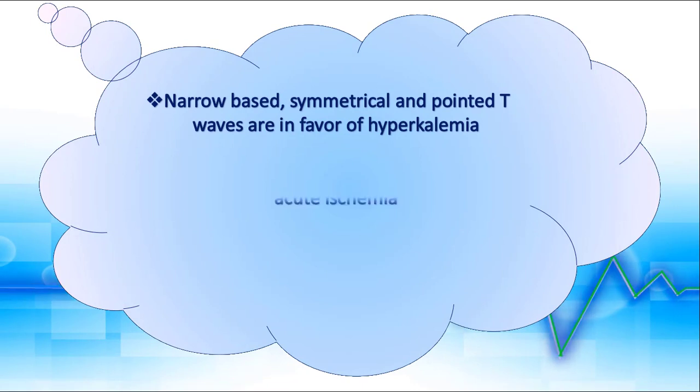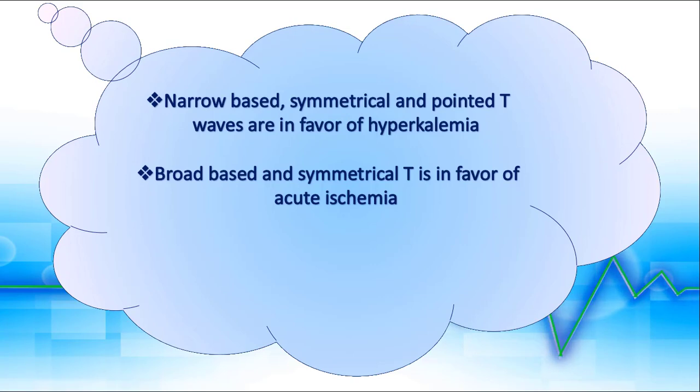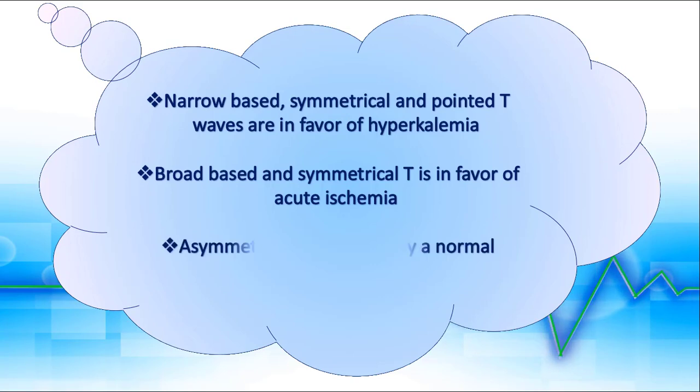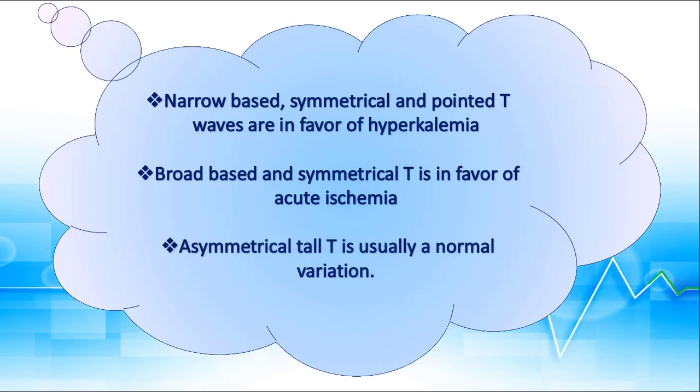In summary: narrow-based, symmetrical, and pointed T waves are in favor of hyperkalemia. Broad-based and symmetrical T waves with concomitant ST elevations or reciprocal ST depressions are in favor of acute ischemia. Asymmetrical tall T waves are in favor of normal variation.